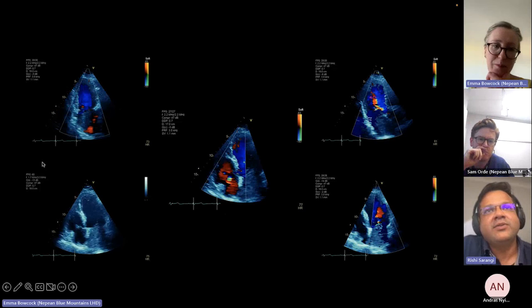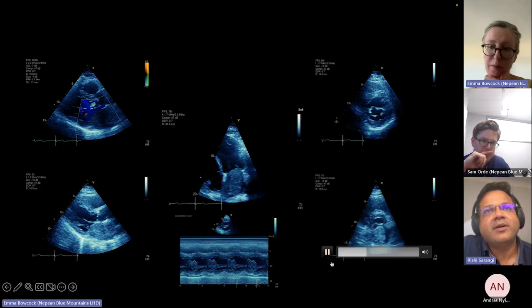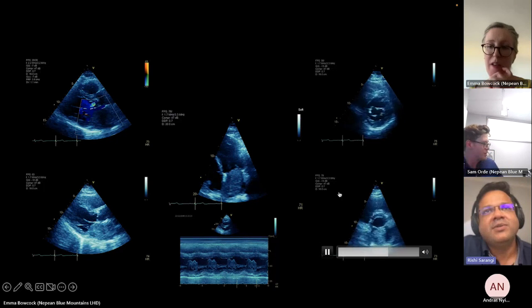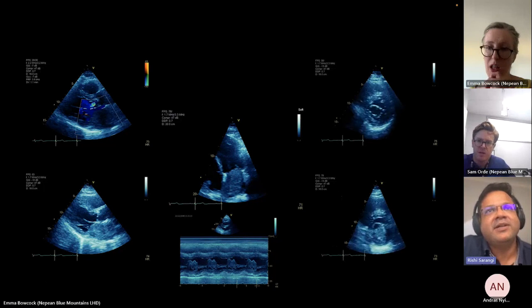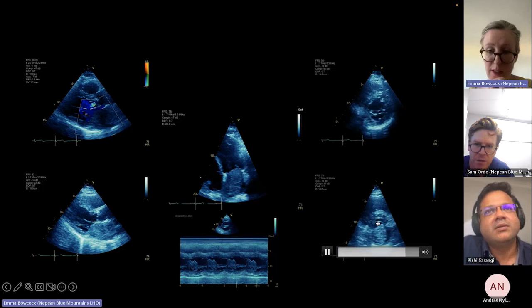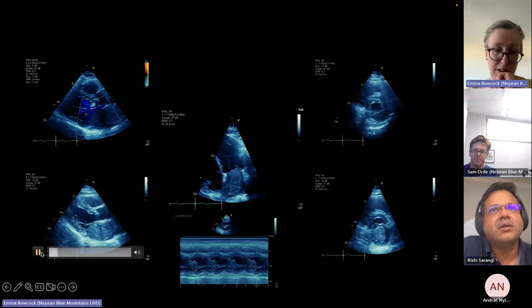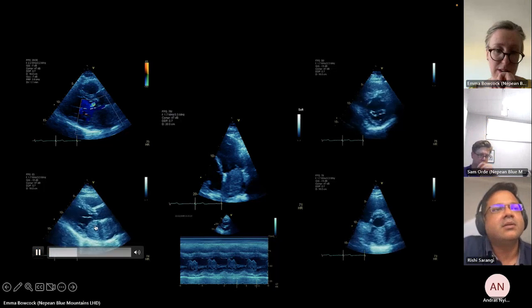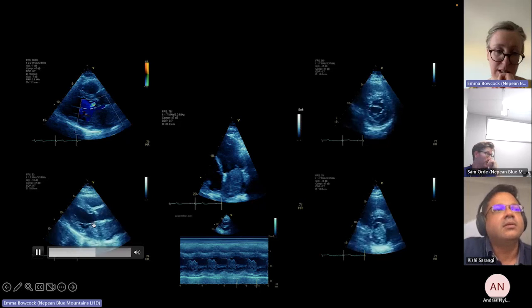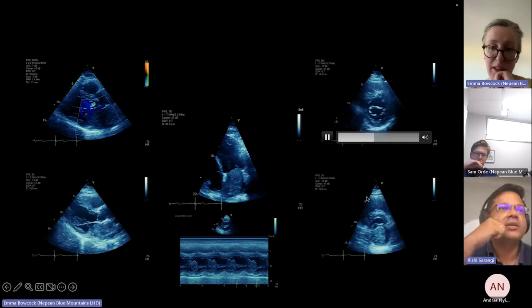Just on the short axis view of that previous image, towards the upper 1 o'clock position, there's something on the mitral valve leaflet motion, which is a bit abnormal with restriction. The anterior leaflet. Yeah. Oh, on this one, you can see it's probably getting caught a little bit by the, so if we see it on here as well. Probably it's getting a little bit caught because that's bulging up into it. Into the left ventricle. Into the left ventricle.